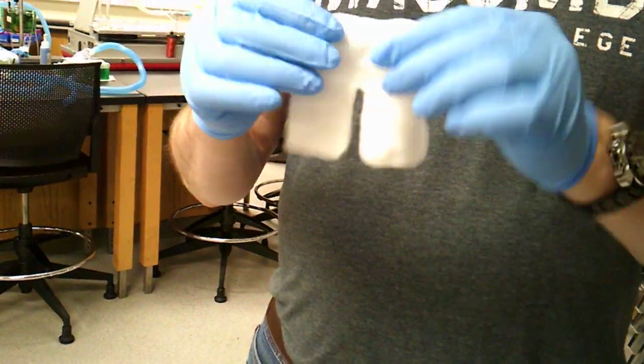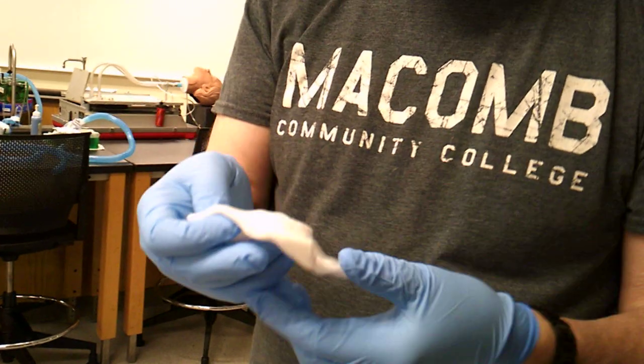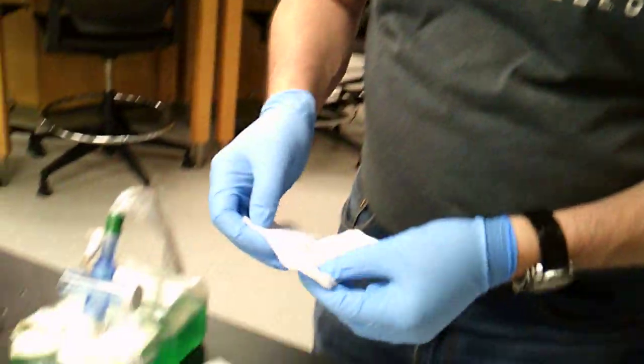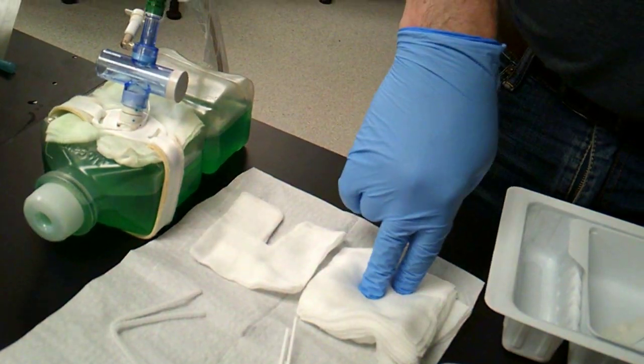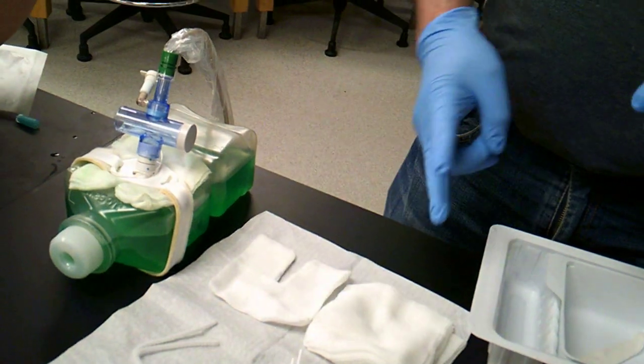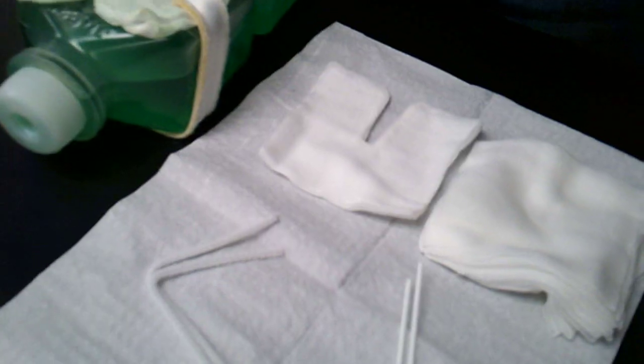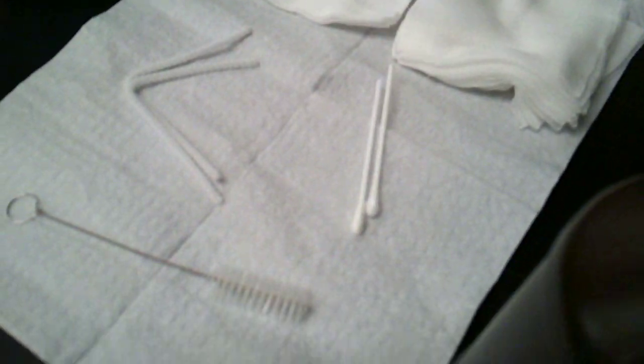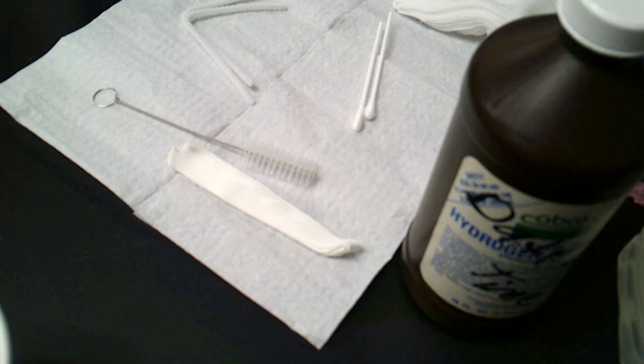Now you'll notice there's one type of gauze pads. Some people call them pants, but this is what we're going to use as our dressing. Never cut gauze. Never cut gauze to make this. You want to have one that is pre-done because if you cut gauze, all those fibers are going to be able to become airborne and potentially cause some problems.